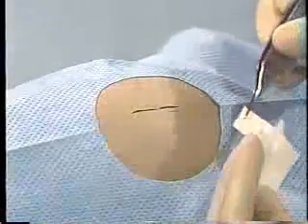Shallow wounds can also be closed using special tapes. Preparation and cleansing of the wound is the same as for suturing the wound. First, dry the skin edges and possibly degrease with alcohol. Remember, alcohol does not go into the wound itself. Keep a sponge handy so that any blood or serum from the wound will not wet the area.